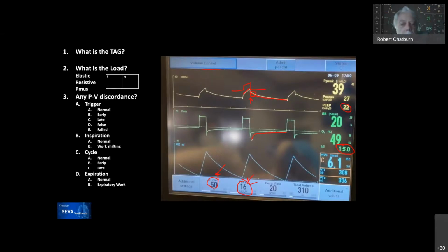Yeah, that's great. And Aman made a very similar point in the chat right now, saying it's essentially the same thing. So this is something really interesting and unusual, but something you should keep an eye on, especially since expiratory filters tend to clog a little more quickly when somebody has an inhaled pulmonary vasodilator like epoprostenol. That wasn't the case in this instance, but it was something that definitely came to mind. Any other comments or thoughts? It can happen sometimes with just giving aerosol bronchodilators. It can happen sometimes with HMEs, depending on where the pressure is being measured.